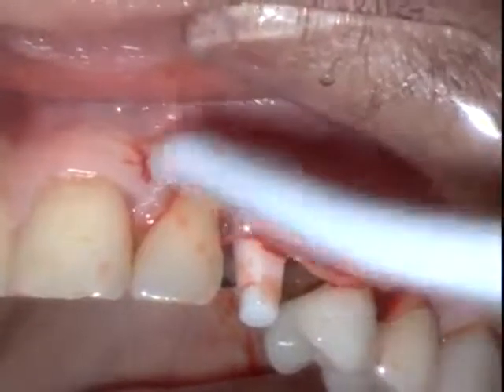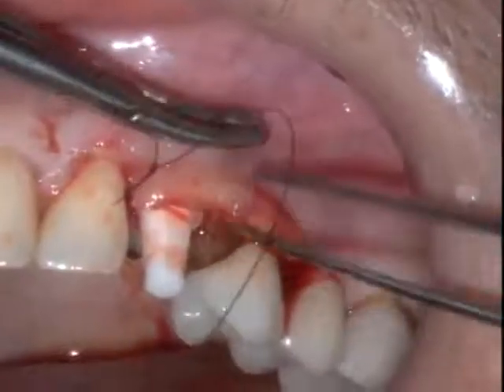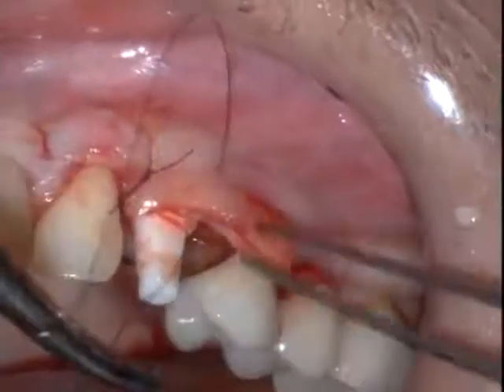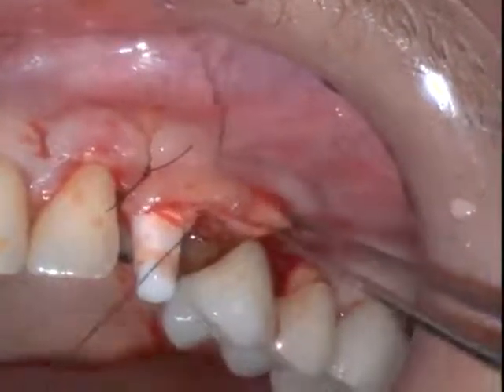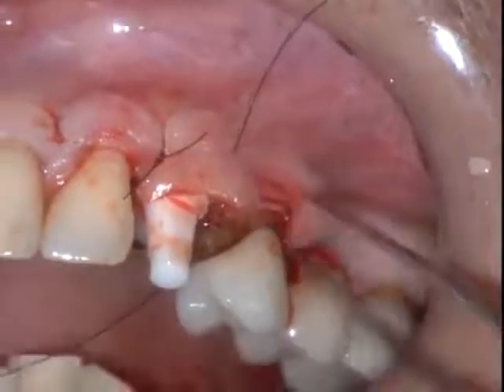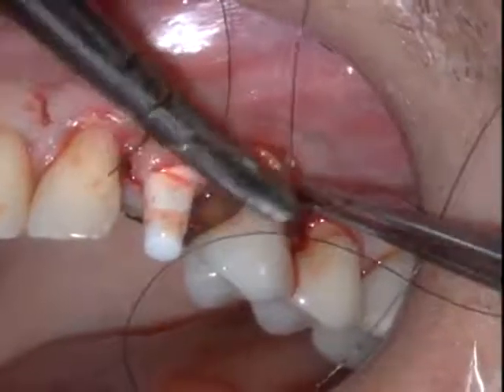Vertical mattress suture individual is utilized to secure the graft. As you can see, a slight piece of the graft on the facial aspect of the maxillary left lateral incisor, and then once again on the distal aspect of the implant, securing it with vertical mattress interrupted sutures.